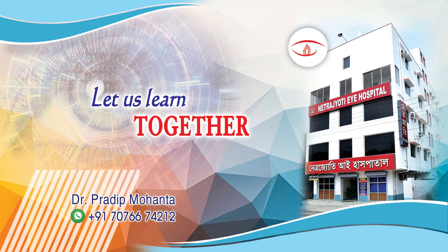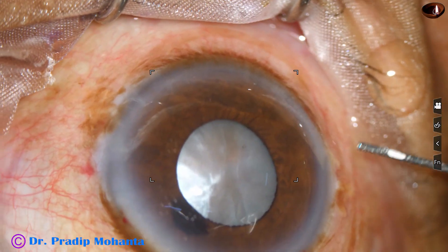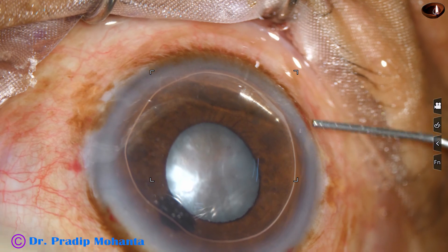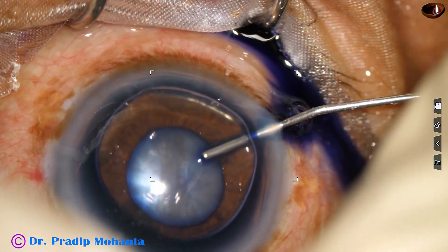Friends, welcome to my workplace at Ranagh Heart, West Bengal, India. In this case, we have three challenges: the pupil is small, the cataract is intumescent, and the nucleus is hard. We have to overcome these three challenges. Let us observe this surgery.